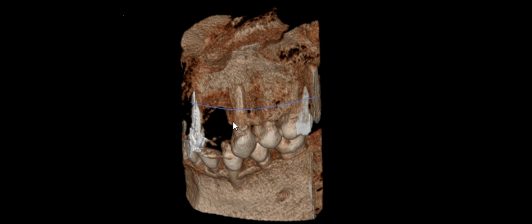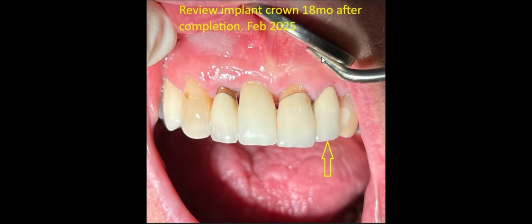Okay, so subsequent to the implant placement and the appropriate waiting periods and the final crown being placed, you can see the crown here that is supported by the implant. The contour of the gum above the implant is not concave, it's nice and full and natural looking. We've got what we call the papilla coming down reasonably nicely, and these adjacent teeth, they've had some old crowns where she's suffered some recession, but they don't show when she smiles, so that's not an issue there.